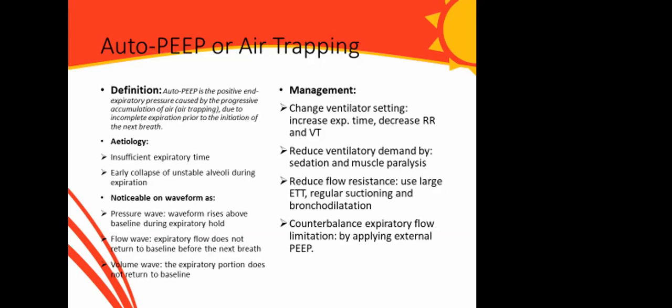expiration. Now the etiologies of auto-PEEP include insufficient expiratory time, which could be the fault of the operator, or you can have unstable alveoli that collapse before the air in them is fully expired.